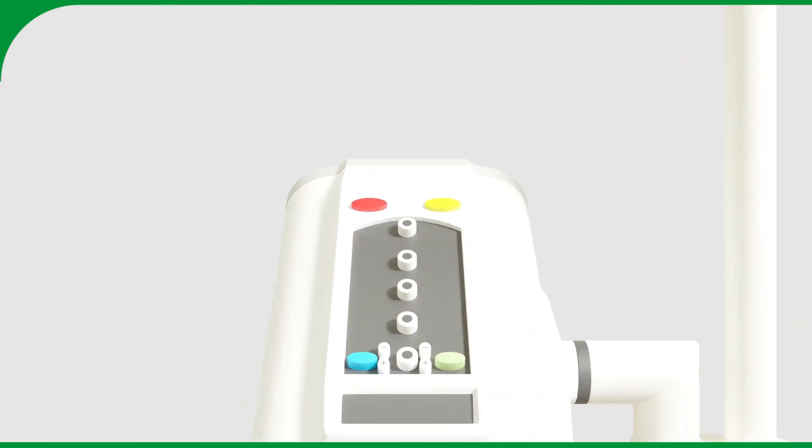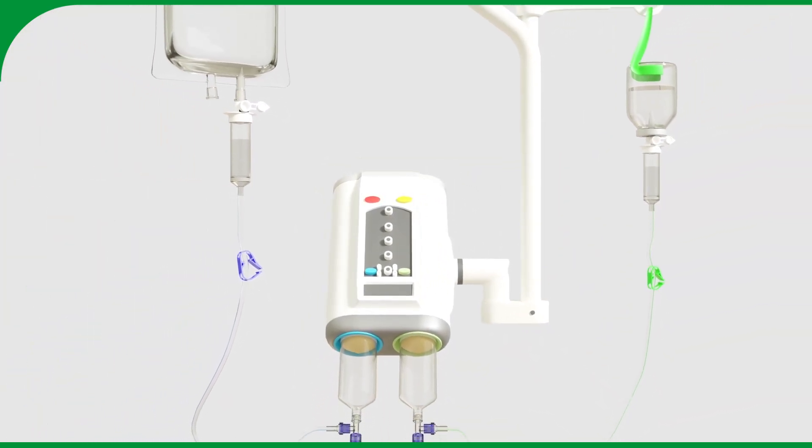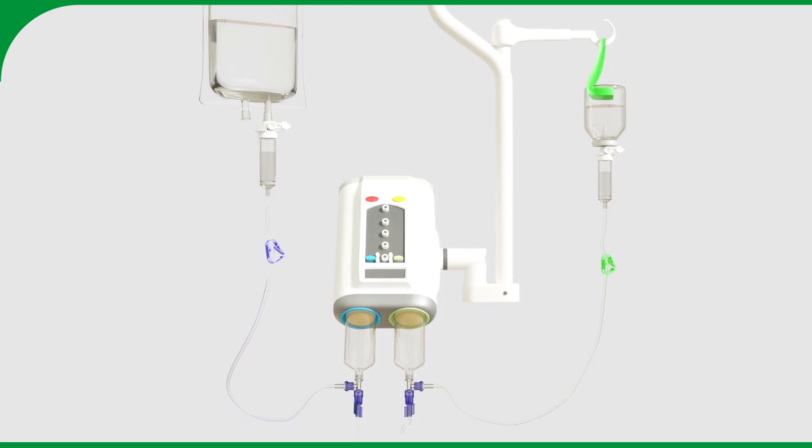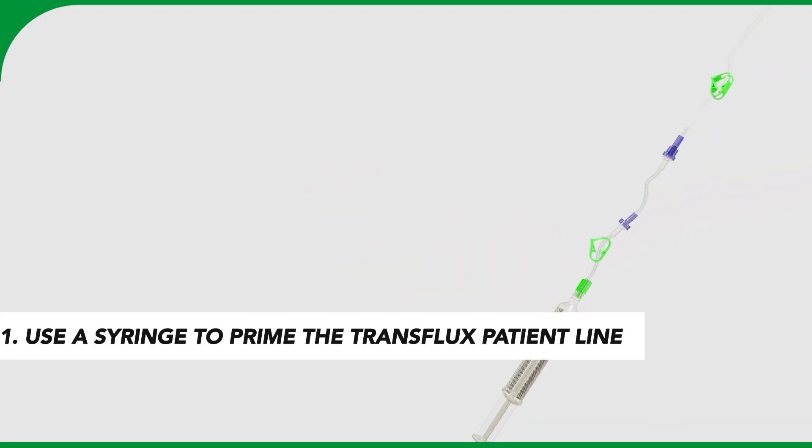The infusion lines are now ready for 24-hour use and ready to be connected to the trans flux or patient line. Once per patient, unpack the trans flux and use a syringe to prime the patient line with saline.